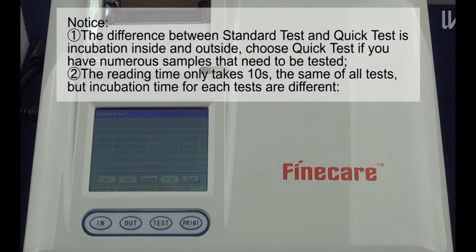Notice: number 1, the difference between standard test and quick test is incubation inside and outside. Choose quick test if you have numerous samples that need to be tested. Number 2, the reading time only takes 10 seconds, the same for all tests. But incubation time for each test is different.